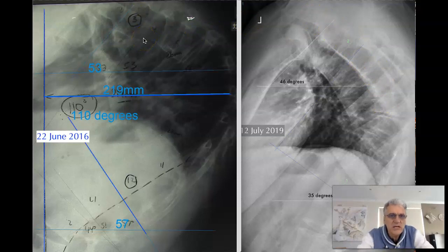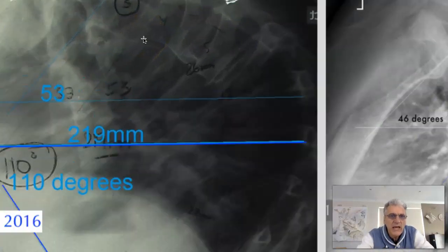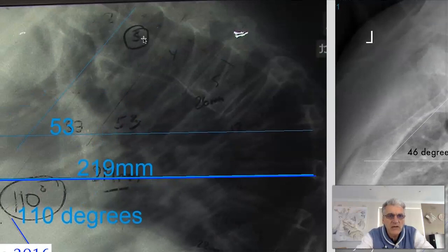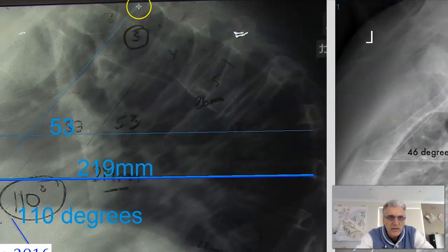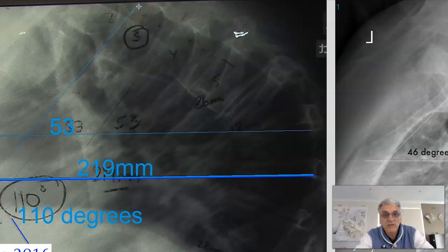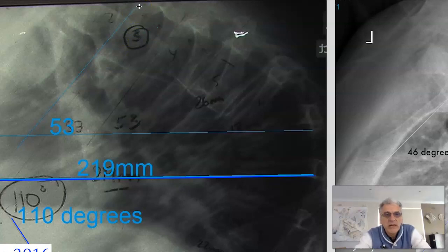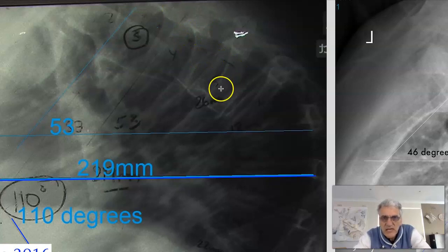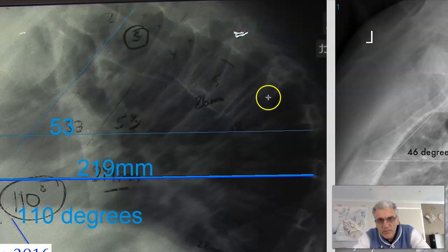We're going to take a look at how you obtain the angles. There are two ways, and you can use both of them and come to the same angle. But the way I like to see is what's taking place with the vertebra.